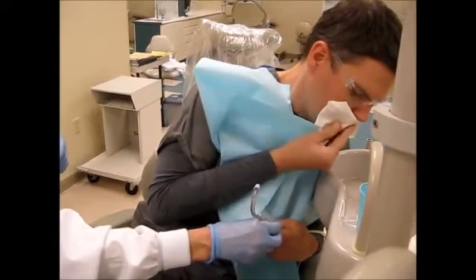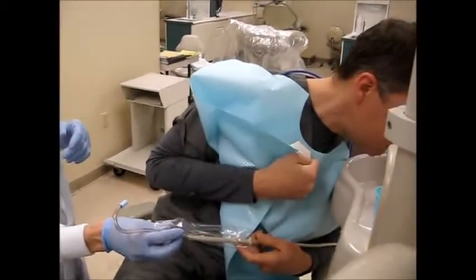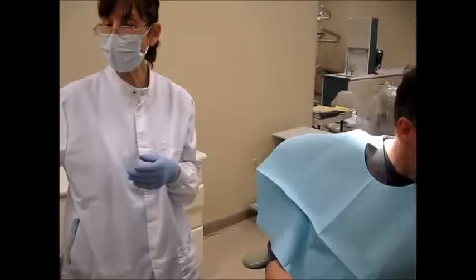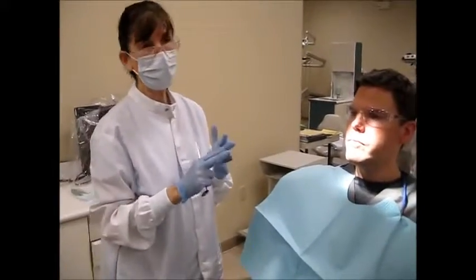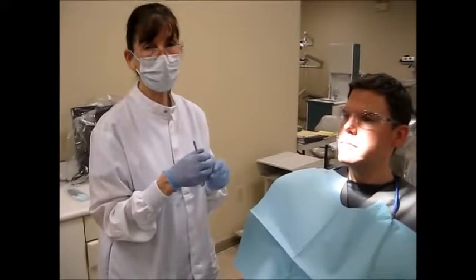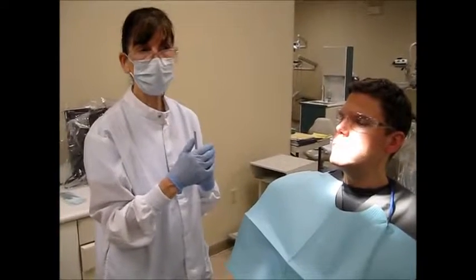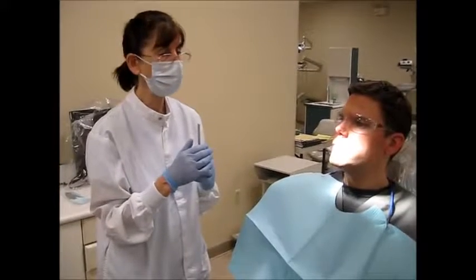At that time, I can also take that saliva ejector and turn it off. That's it. And you want to make sure that they expectorate everything, that they do not swallow any of that fluoride. And I'm reminding the patient at this point that the patient is unable to eat, drink, chew gum, smoke if they smoke, anything that would disrupt that fluoride bond at this point for 30 minutes. So I would observe the clock and let them know exactly what that time was. So if I finish the fluoride treatment at 8 o'clock, it would be 8:30 that I would give them for a time.